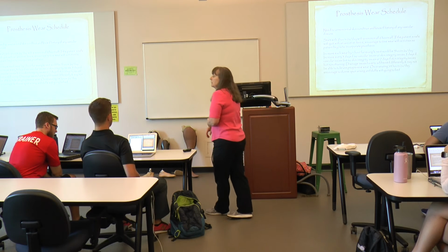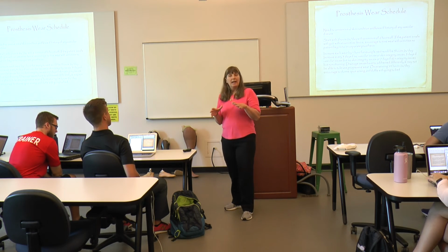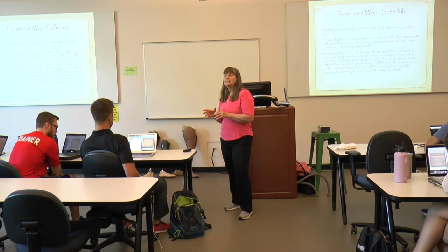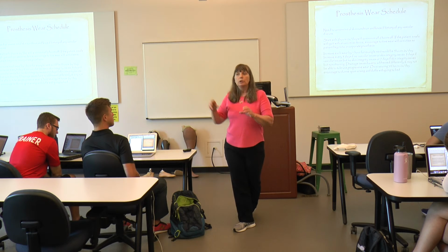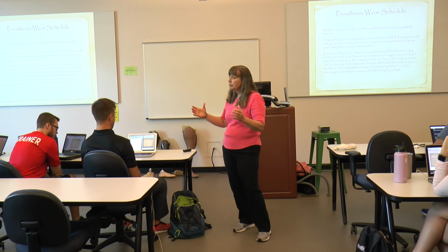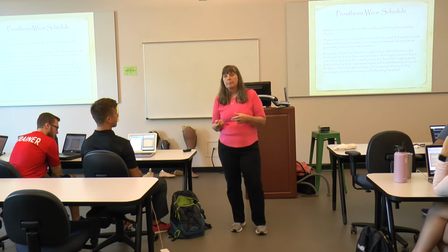Typically what I do is I start most patients 2 hours twice a day. If they've already had the leg a while and they've been wearing it, I take into account how long they're wearing and what their skin looks like, and vary it. But I do twice a day because one of the issues is that sweating environment. So I can get more time total and give it a break so it's not so sweaty and wet if I do twice a day than one long period. So typically what I do is start at 2 hours twice a day.